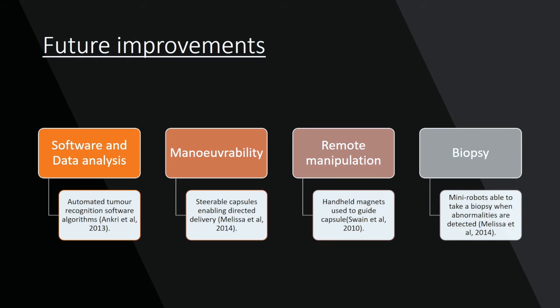And the last point being biopsy. The current system is only a camera system, but future improvements can include biopsy techniques integrated into the pill. Therefore, it does not require a separate invasive procedure to act on the content seen by the camera. Therefore, it will act as a two-in-one integrated system.